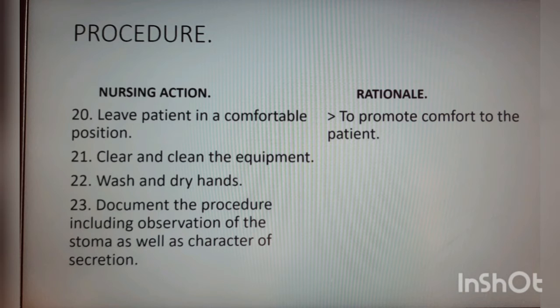Next, document the procedure, including observation of the stoma, for example the presence of irritation, redness, edema, subcutaneous air, as well as character of secretion, like the color or any purulence.